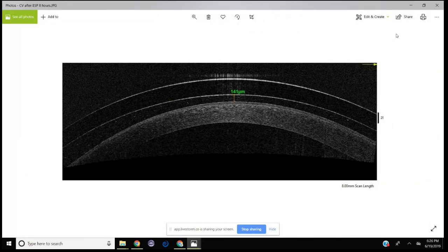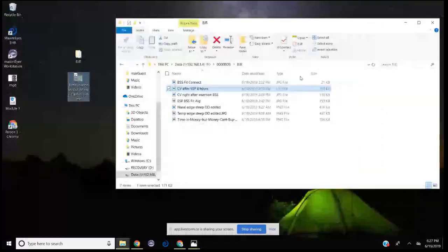So it picked a lens, regardless of haptic, that did not touch the center of the eye. That's huge because I don't want to have to try multiple lenses on the eye just to realize that I have central touch. That's a waste of time. So the central vault, based off the Eaglet sent to Boston Sight, could not have been more spot on. Looking at the landing, I want to show you what it said.